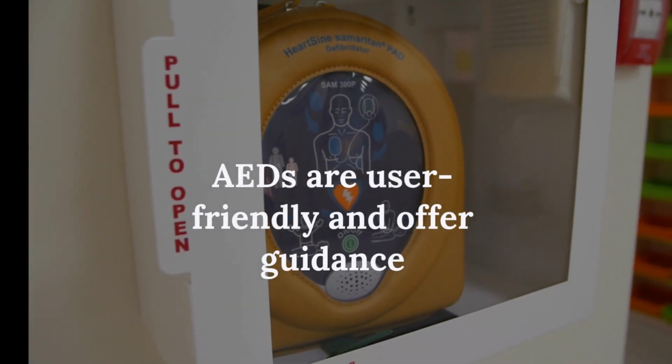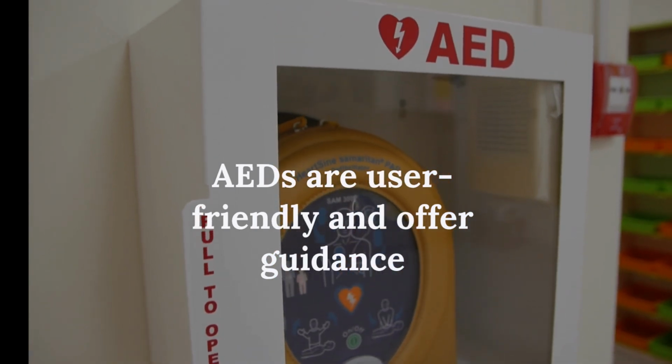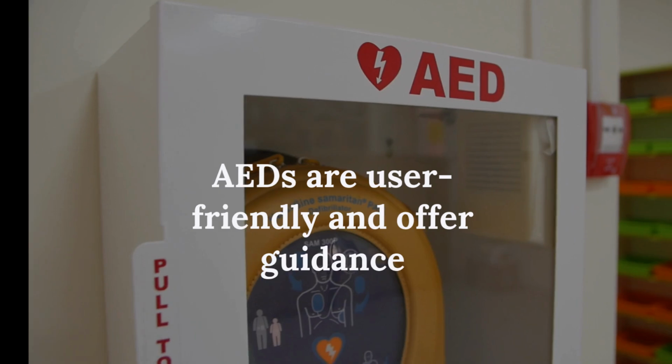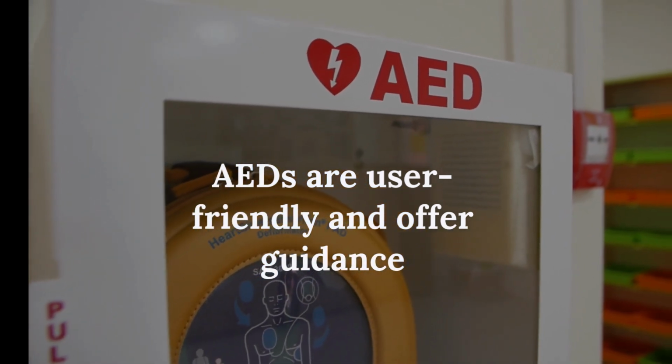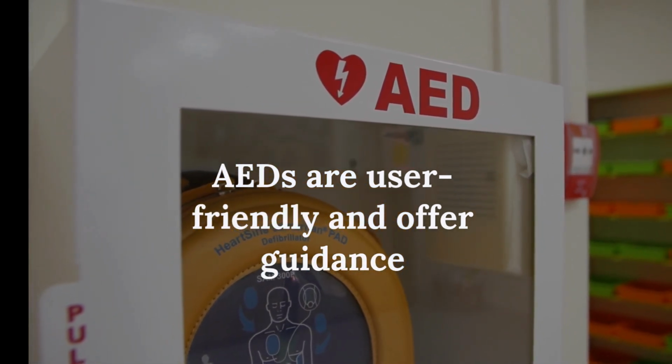An AED can be used by anyone. It analyzes the heart's rhythm and advises if a shock is needed. Follow voice prompts and visual cues. Public AEDs are common in many locations. They will not shock if not needed.